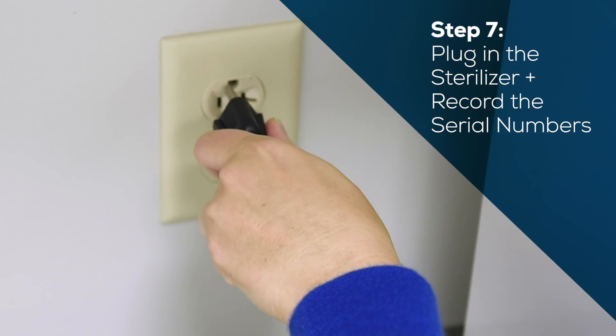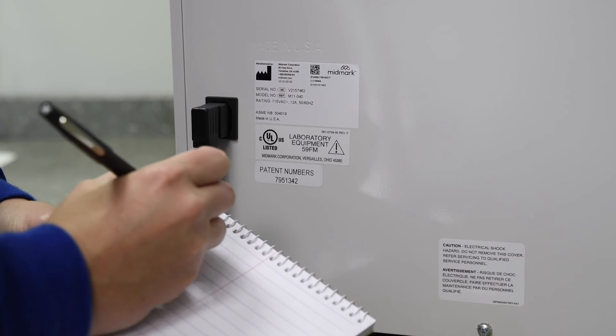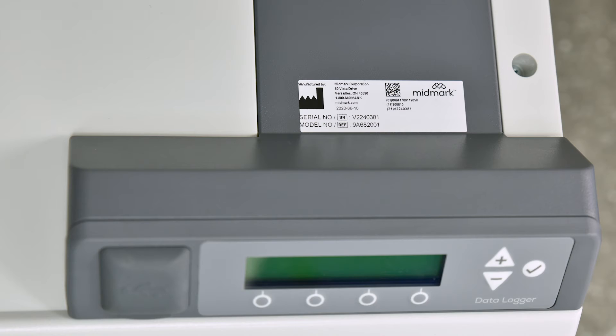Plug the sterilizer cord into the wall outlet and the power inlet on the back of the sterilizer. Record the serial numbers of the sterilizer and data logger.